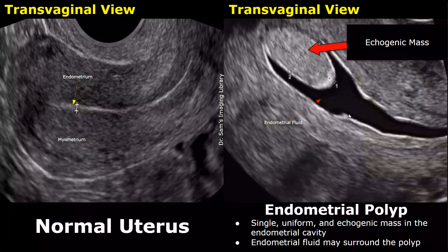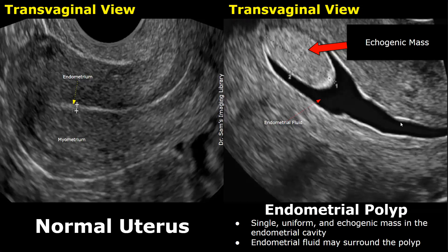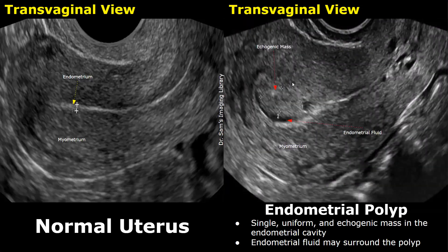In this image, along with an echogenic mass in the endometrial cavity, we have anechoic fluid surrounding the mass. Sometimes an endometrial polyp may be surrounded by endometrial fluid. This is another image showing an endometrial polyp occupying the endometrial cavity, with a small amount of fluid around the mass.